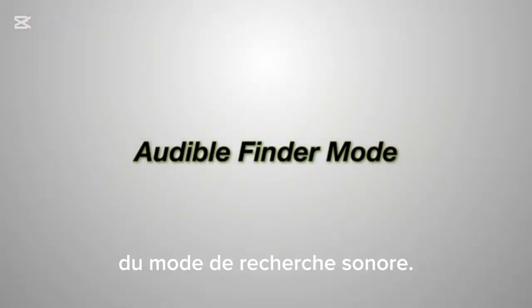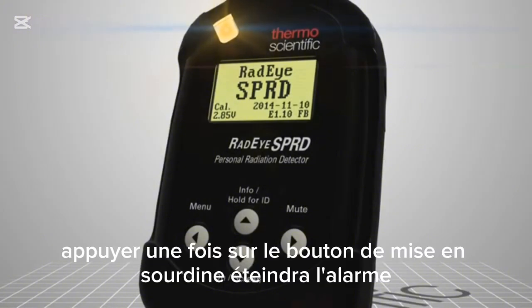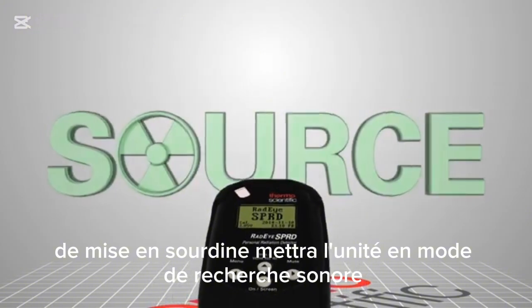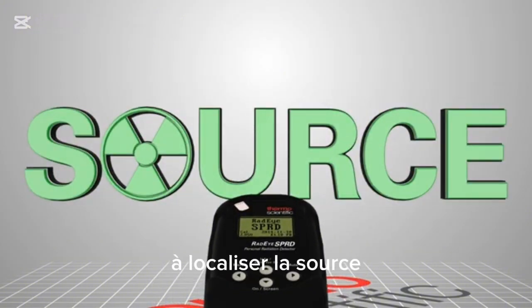Audible Finder mode. When the alarm sounds, pressing the mute button once will silence the alarm. Pressing the mute button a second time will put the unit into Audible Finder mode to help you pinpoint the location of the source.